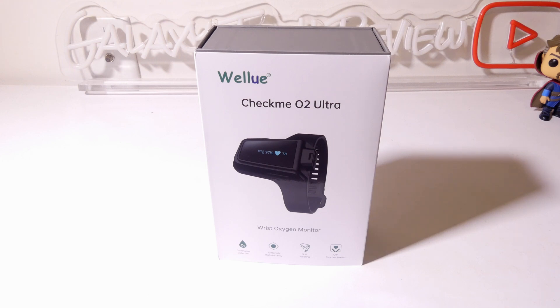Hey everybody, it's Luke over at Galaxy Tech Review and today I have the WellU CheckMe O2 Ultra wrist wearable SPO2 and heart rate monitor. This is great for people that may have a need to check their heart rate and SPO2, especially overnight. It boasts up to 100 hours of continuous battery life and a two hour charge time. This is a great thing for overnight checking, maybe if you're in aviation and need to check your SPO2, or just for general well-being. We're going to dig into it now.